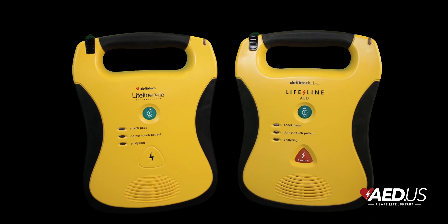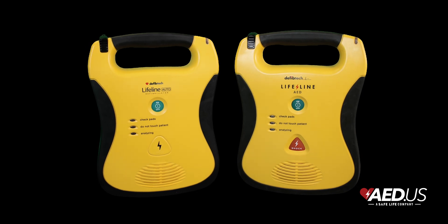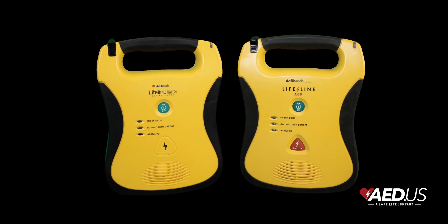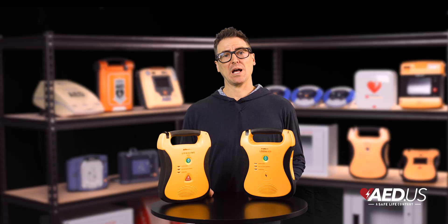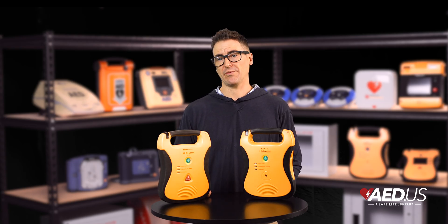The DefibTech Lifeline AED is a reliable, user-friendly device built to handle emergencies with ease. Its rugged design, long battery life, and intuitive features make it an excellent choice for a wide range of environments.